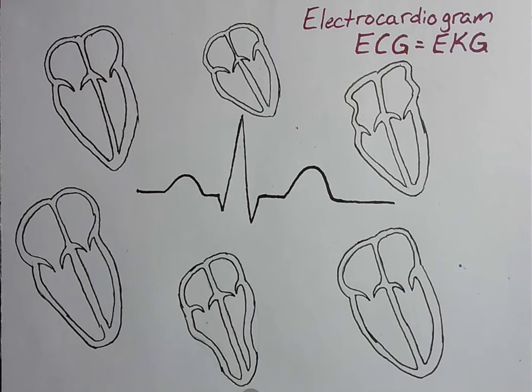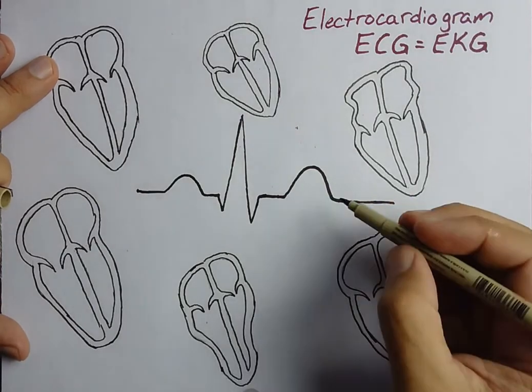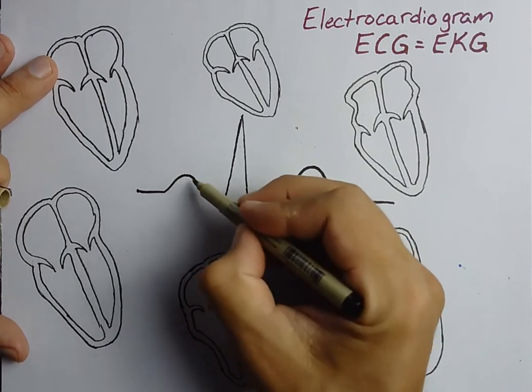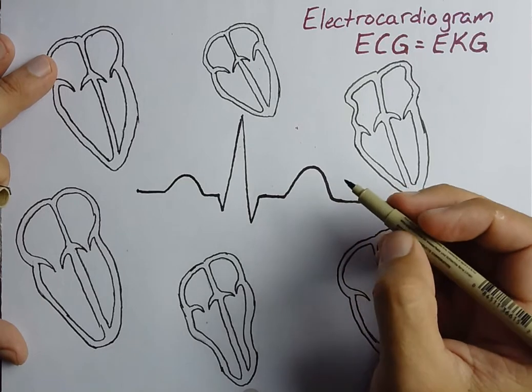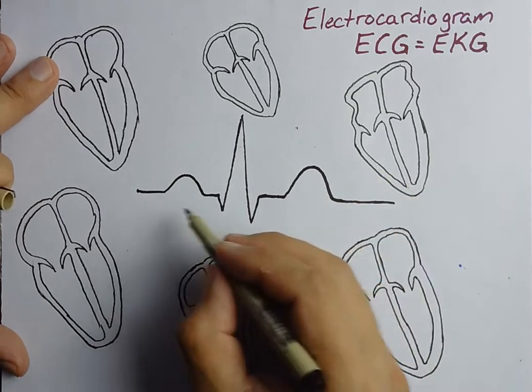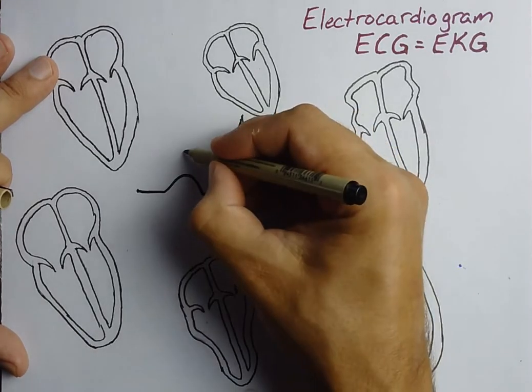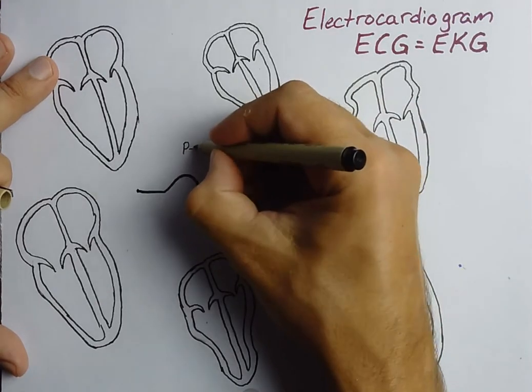Once you get done with that, we're going to label this thing. Okay, so now we're just going to find the anatomy, and say what anatomy looks different from the rest of the graph. I'd say the first thing that looks different is this first hill right here. I actually don't know why we started with P, but this just goes through the alphabet. The first anatomical feature is a P, and it's going to be called a P wave.